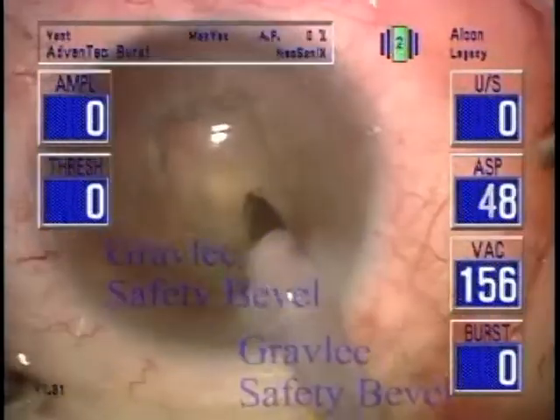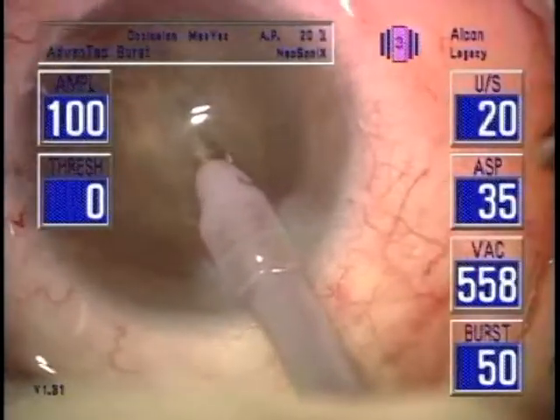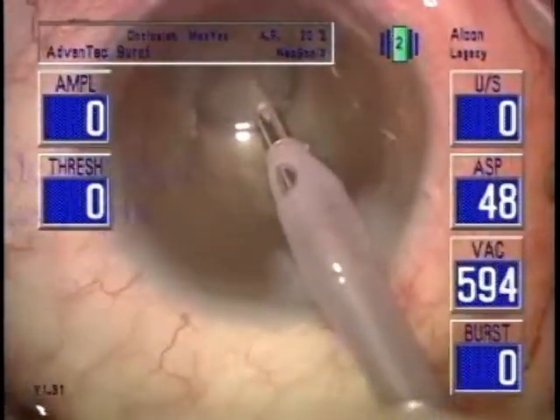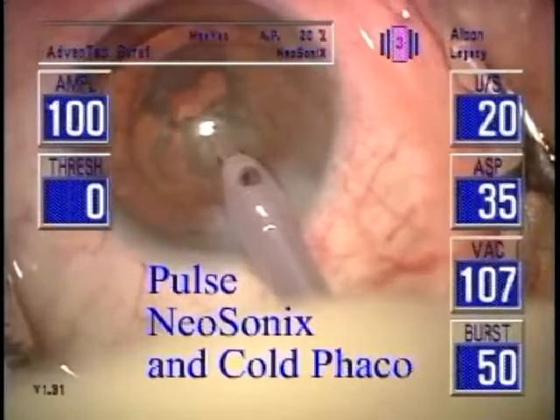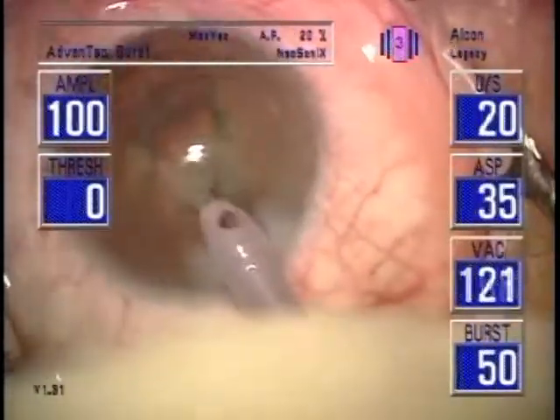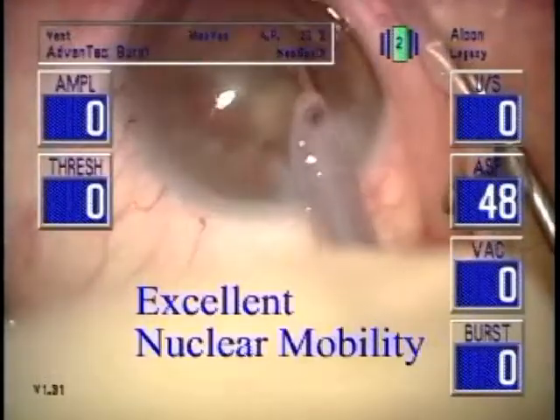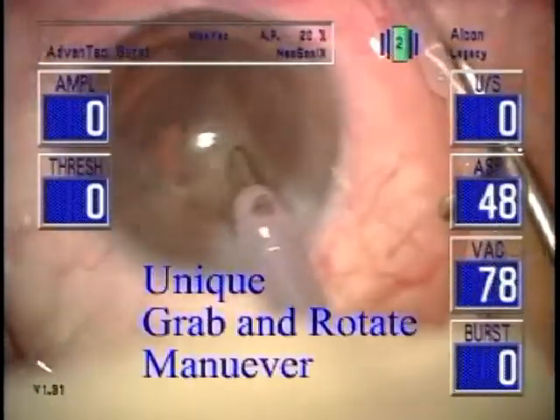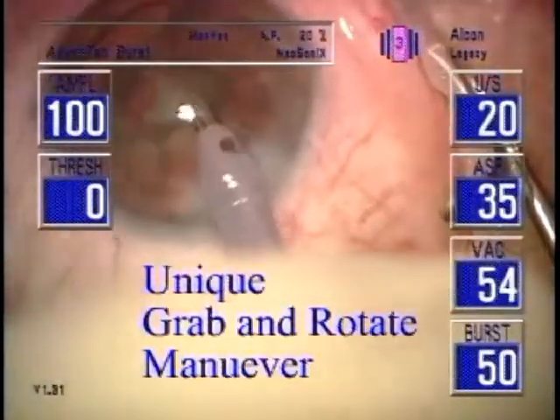Further benefits include minimizing potential for collapse of the corneal dome, as well as iris flutter and iris miosis. Notice in this case a three-way endonuclear dissection along the embryonic suture lines. Also note the incredible ability of the probe to grasp, occlude, and lollipop into a section of endonucleus so that it can be mobilized centrally. Note there is no chatter. The followability is excellent without spindling of the nucleus around the probe. A second instrument is not required, but will give even greater efficiency. This is a very dense cataract, and the red reflex progressively improves as the case proceeds.